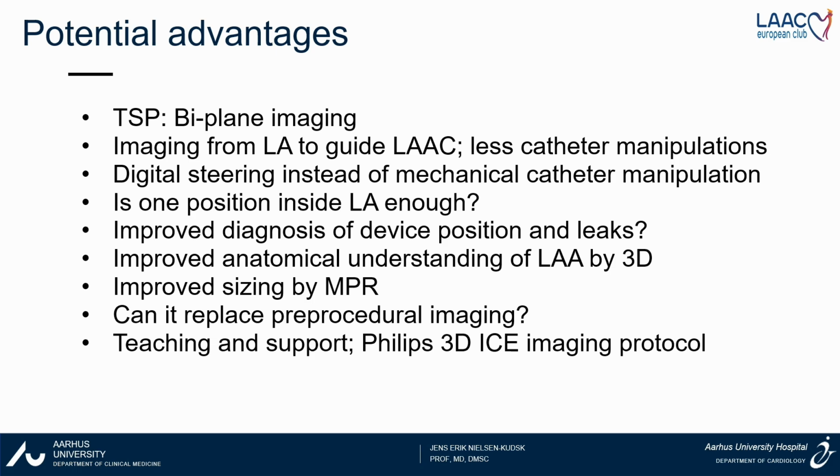I think we can get an improved anatomical understanding of the left atrial appendage by this technology. We can do sizing by MPR, and it also raises the question of whether in the future we can maybe skip pre-procedural imaging and go directly to a 3D ICE-guided workflow.